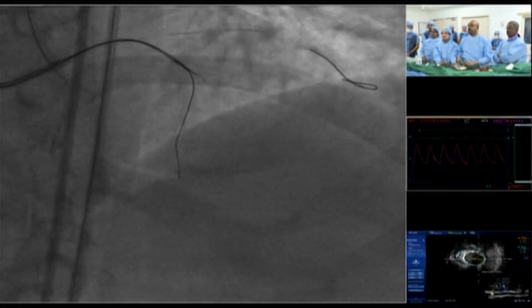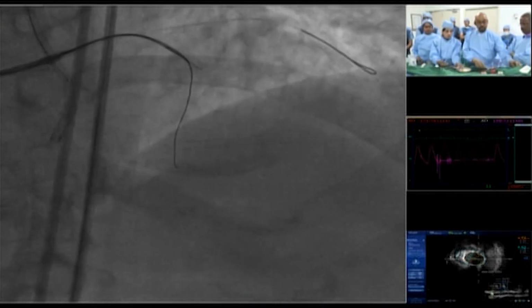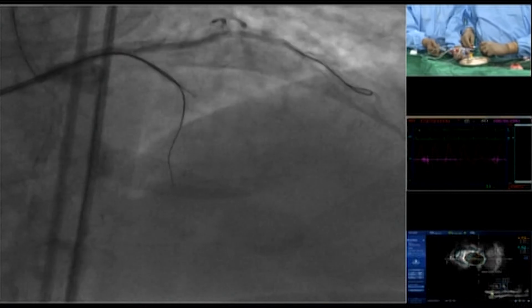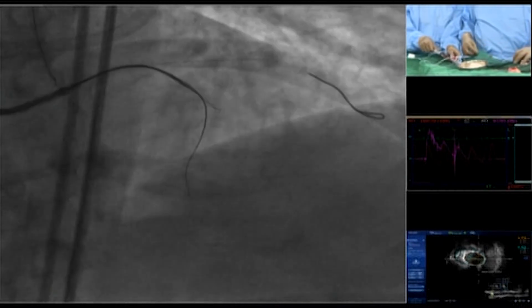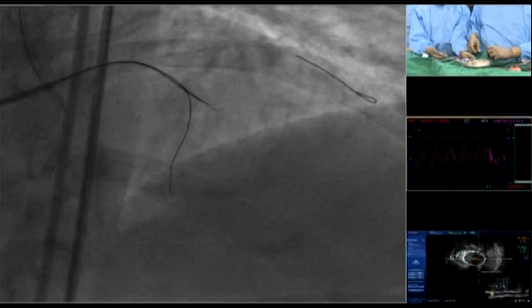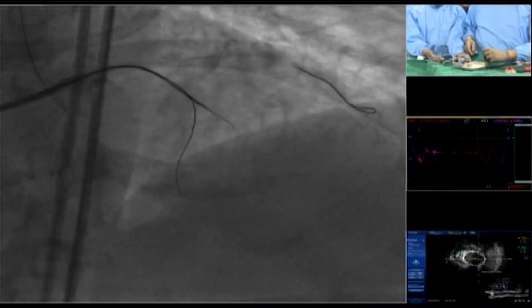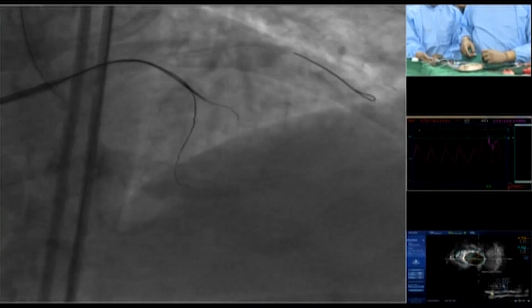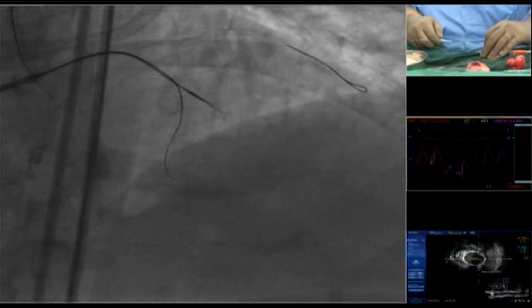From my perspective, it was quite risky to start with the last remaining vessel. I wouldn't recommend it. Why? Not because I have good experience, I have bad experience. Last remaining vessel, similar situation: you just go with a wire, maybe with a balloon, pressure is going down until you start resuscitation, and this sometimes ends fatally. You know, patients die. So you're lucky. Your patient is very lucky because you could manage this very easily.